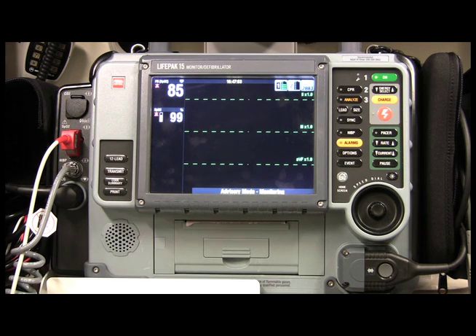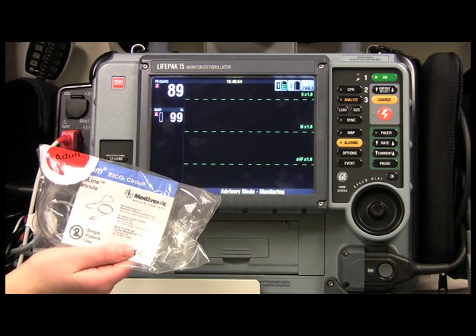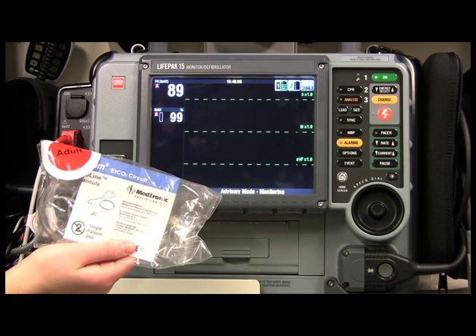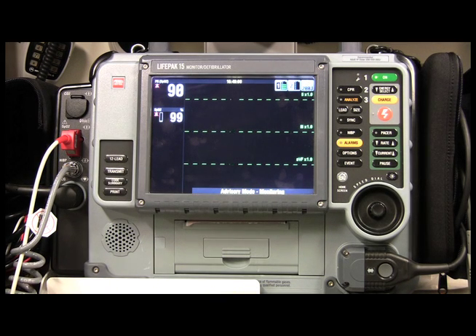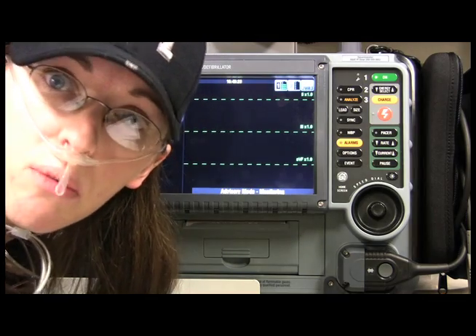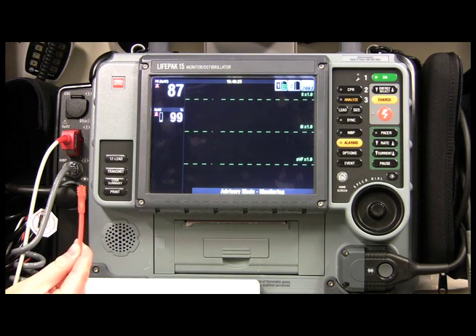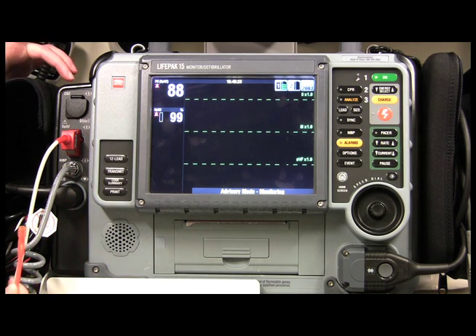Let's say you have a patient with asthma, COPD, or difficulty breathing and you want to monitor capnography. You can use one of these special nasal cannulas that have an extra piece on them. They look like regular oxygen nasal cannulas but they're different — they still have prongs for the nose and wrap around the ears, but they're designed for CO2 monitoring.